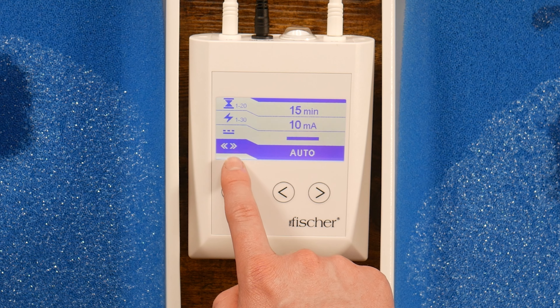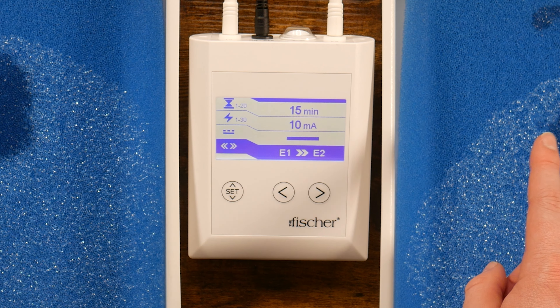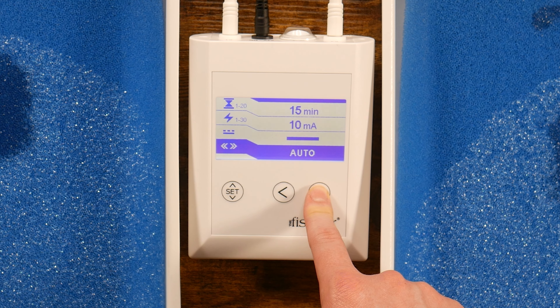Last, you can adjust the direction of current flow. We recommend that patients use the Auto setting. Some patients report a faster decrease in sweat from the treatment being on the positive polarity. In the manual setting, the arrows will be pointed towards the positive electrode. Then, press the Set button again.